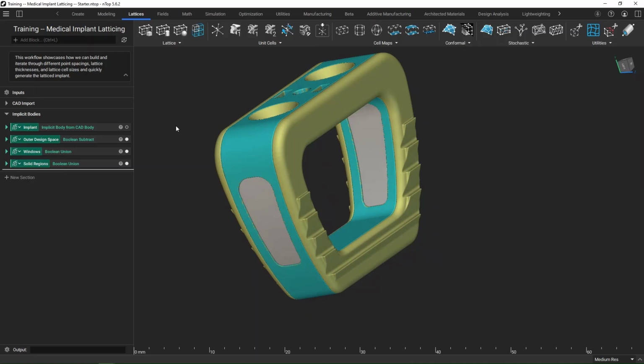But again, just going through a couple of different latticing techniques. First up, Voronoi latticing, so that we can look at that osseointegration and how really affect how that implant is going to function once it's connecting back into the body. We've got some periodic lattices we'll talk about just for lightweighting this chunk, as you can see right here. And we'll also get into using custom blocks so that we can see how we can automate this workflow, really take advantage of our reusable workflows to find that ideal implant from there.